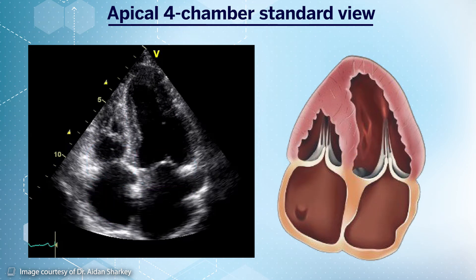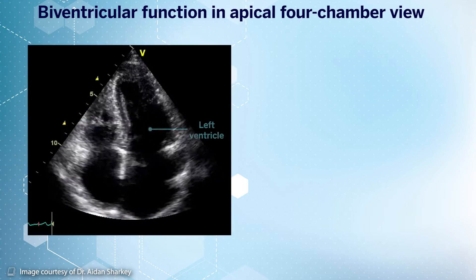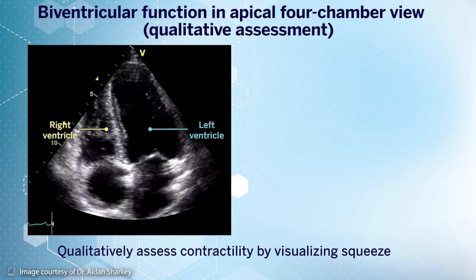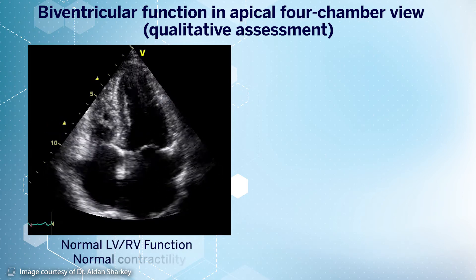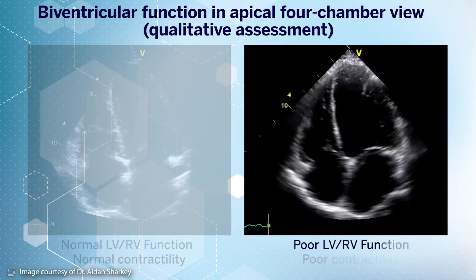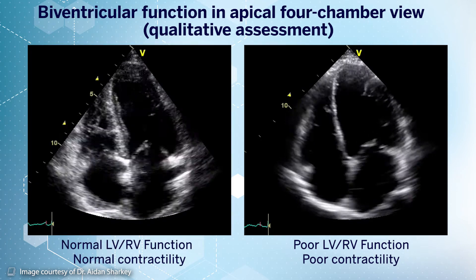This view has many basic and advanced uses. Assessment of biventricular function is one such basic use of the apical four-chamber view. The function of the left and right ventricles can be qualitatively assessed by eyeballing cardiac contractility. The video loop on the left shows normal left and right ventricular function, while the clip on the right demonstrates poor contractility of both ventricles, representing a patient with reduced biventricular function.